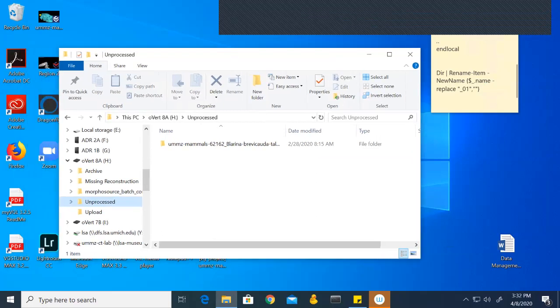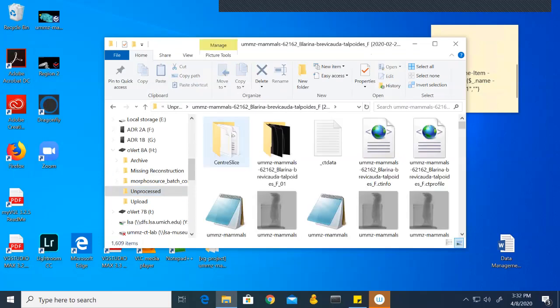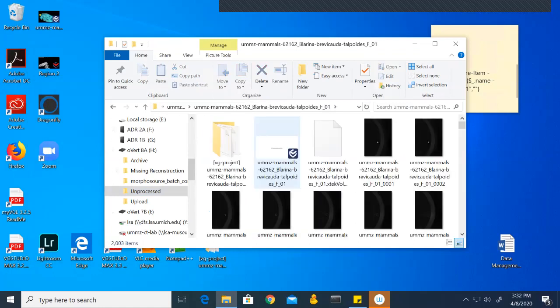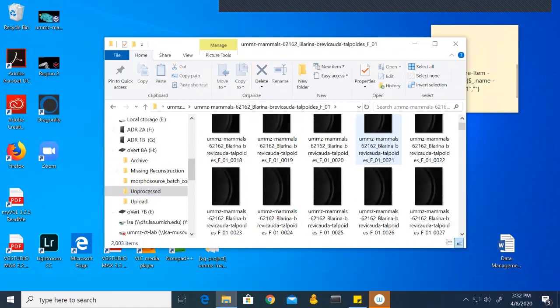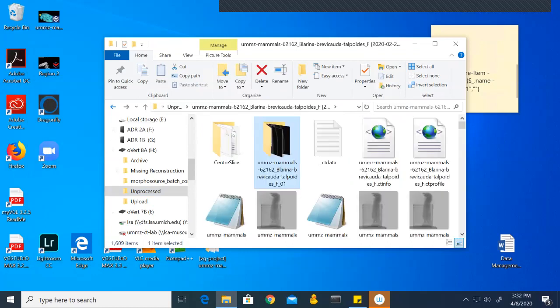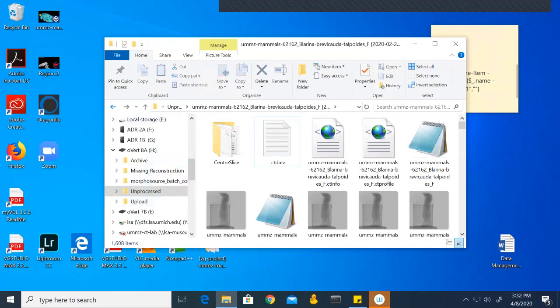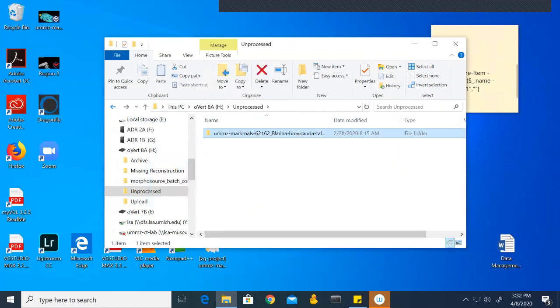Next, we have to compress the TIFF files. If I open this file, you can see the second folder contains all the TIFF files. This is the folder we need to compress. I'm going to move it to upload, and again this would be done for all the specimens.